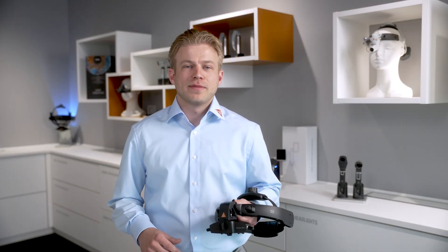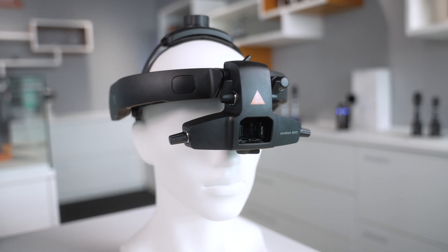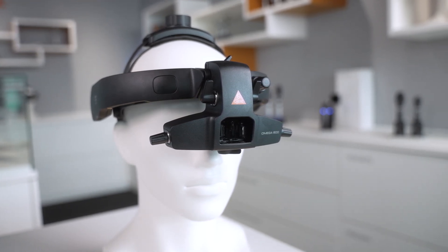Hey there, I'm Lucas from Heine, and in this video I'll take you through how to set up your Omega 600 Binocular Indirect Ophthalmoscope, or BIO for short. We'll go step-by-step through the initial setup, and I'll highlight a few important features that will help make you feel more confident when using this device in your program and in clinical practice.